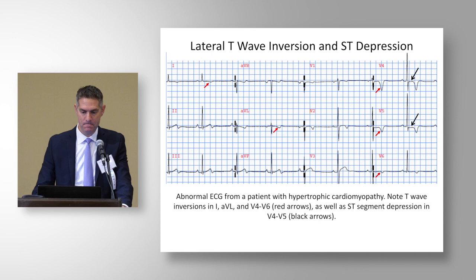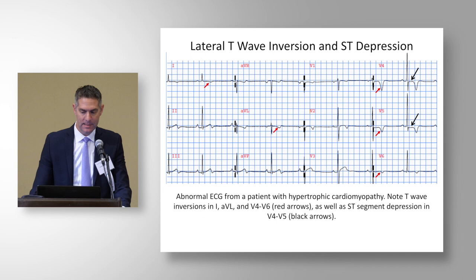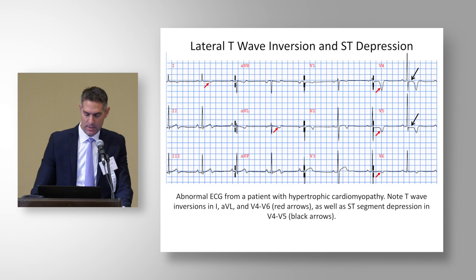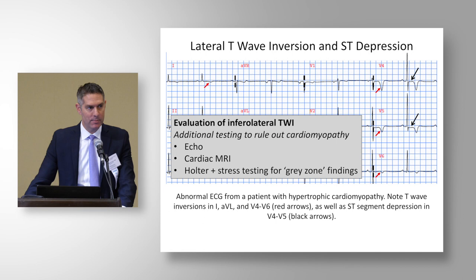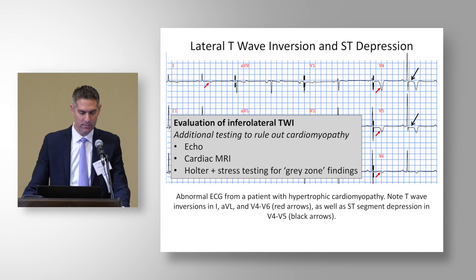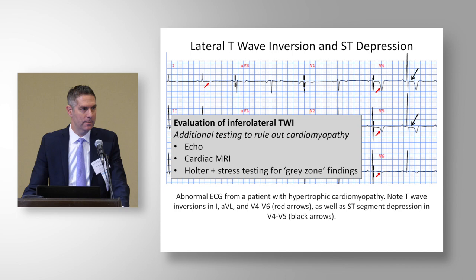Here's another example of lateral T-wave inversion and ST-segment depression — in V4, V5, V6 — showing a pretty deep T-wave inversion, defined as more than two millimeters or two small boxes. It's important to link our abnormalities to the recommended evaluation. In this ECG, the recommendation is an echocardiogram, cardiac MRI, and then for gray zone findings, ambulatory ECG monitor or Holter and cardiac stress testing.